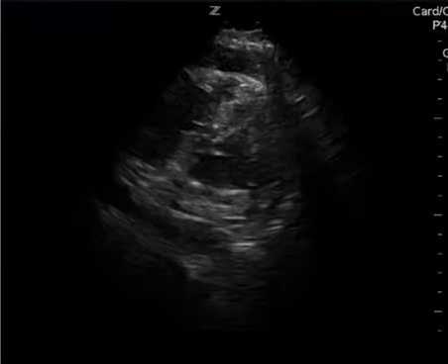To try to counteract that, you can move the probe a little bit more towards the patient's right and use the liver as a window, but I understand that can be challenging. So I hope this helps.